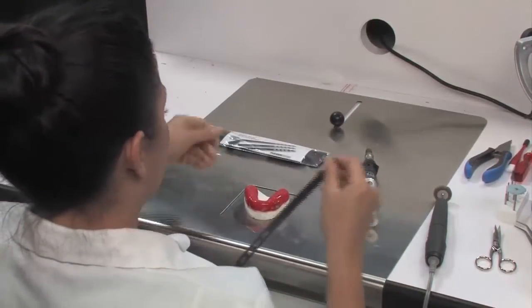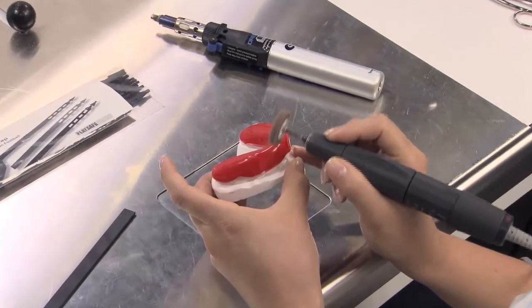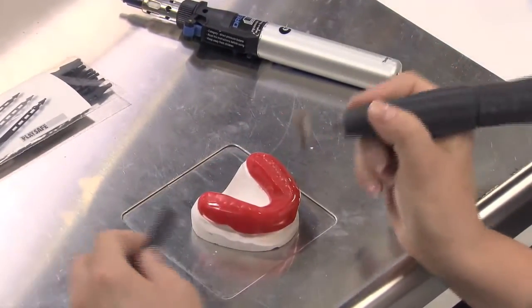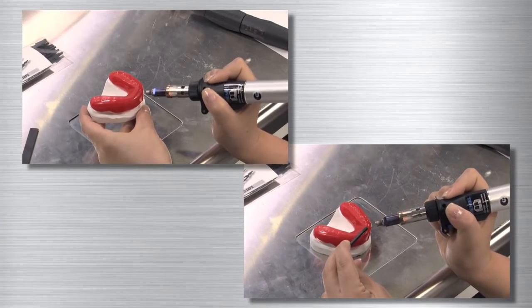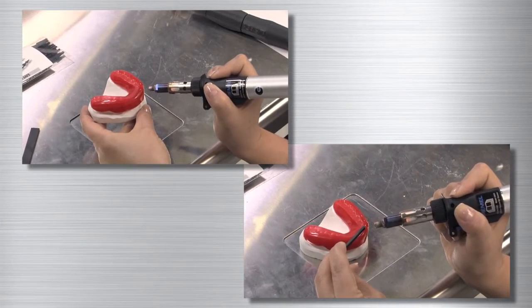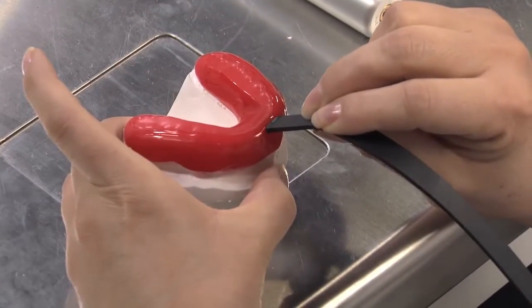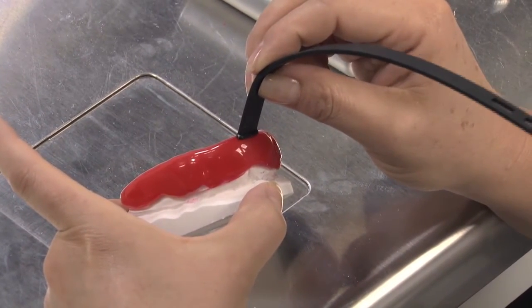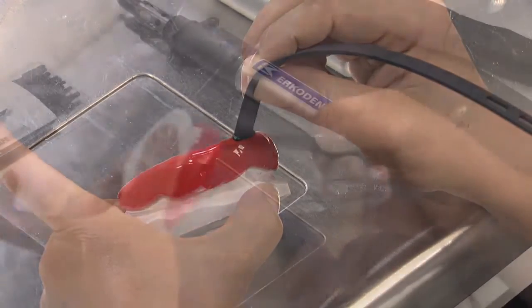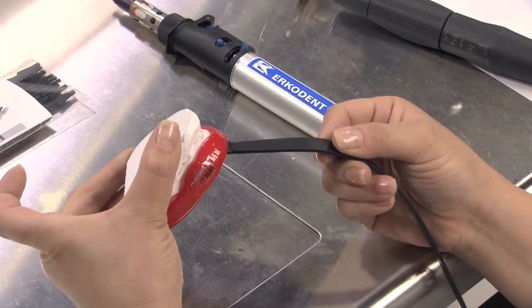Now to add the helmet strap. Using a low-speed handpiece and a brown LISCO disc, roughen the anterior portion of the appliance. Next, take the helmet strap and roughen the end of the strap in the same manner. Then, use the hot air pen to melt the two pieces where they were scored. Before the material gets a chance to cool, apply the helmet strap to the appliance to create a strong bond. Once it has cooled, lightly tug on the helmet strap to ensure they are properly connected.